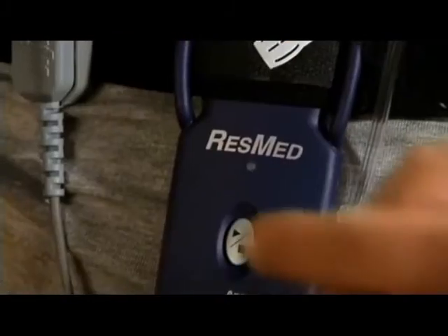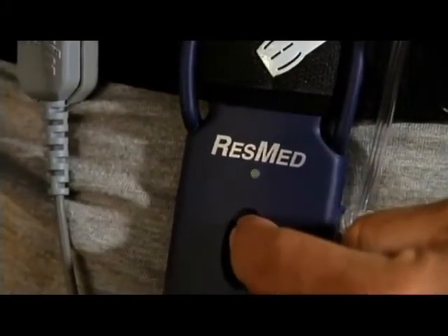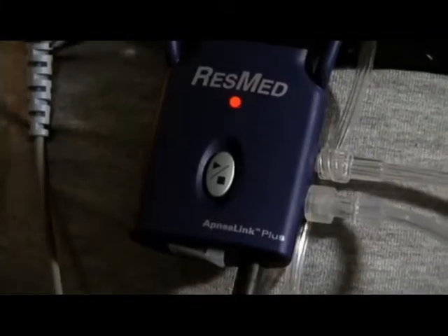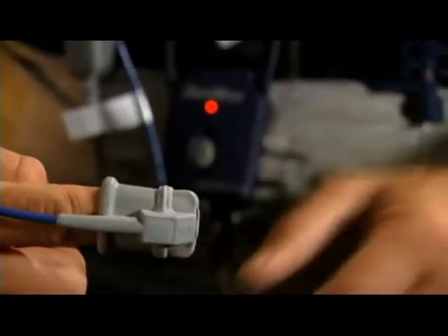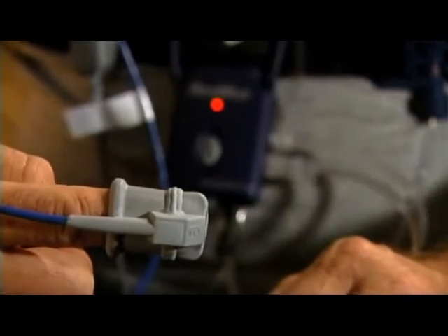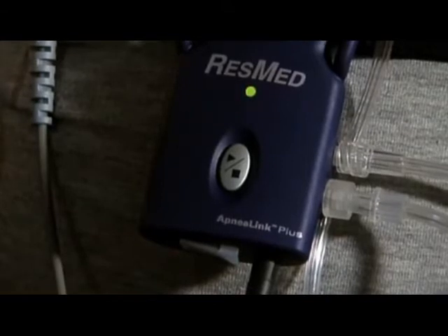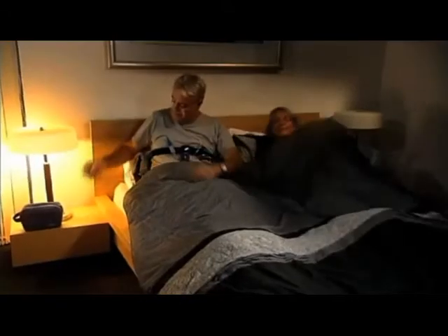Turn the ApneaLink recorder on by pressing and holding the on switch until the green light illuminates. This will dim around 10 minutes after recording begins. If the light shows red, check that the pulse oximeter and finger pulse sensor are properly connected — once corrected, the light will show green after a few seconds. If the light stays off altogether, the batteries probably need to be replaced.